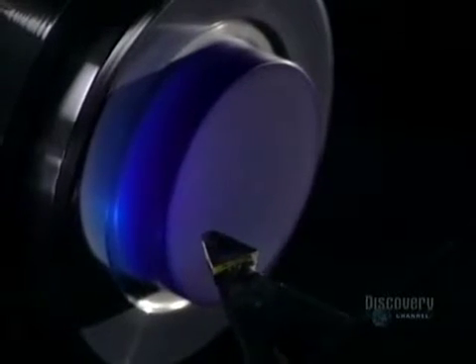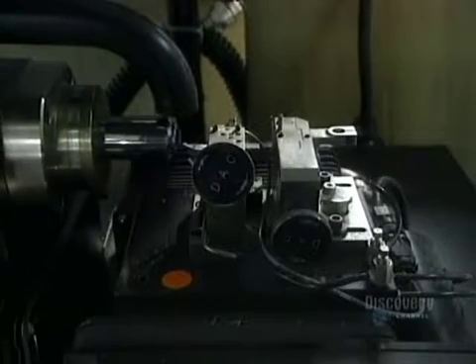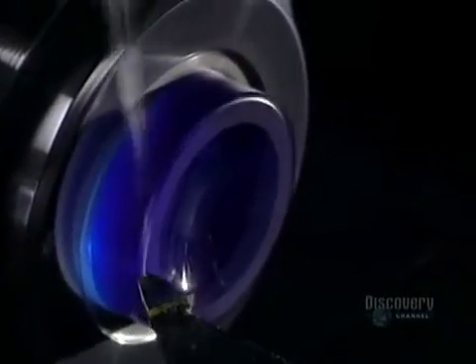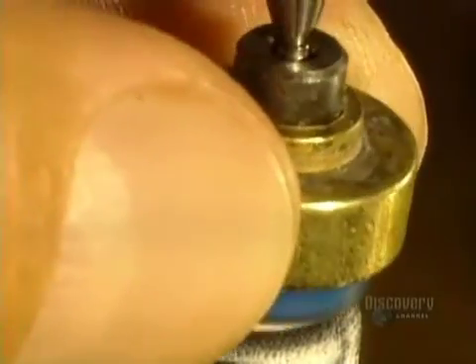They begin by shaping the inner curvature of the lens. This digital lathe, rotating at 6,000 revolutions per minute, is equipped with an industrial diamond. It shapes the inner surface — the part that touches the cornea — which must be free from any abrasion and imperfection, and is polished with a super-fine abrasive paste.